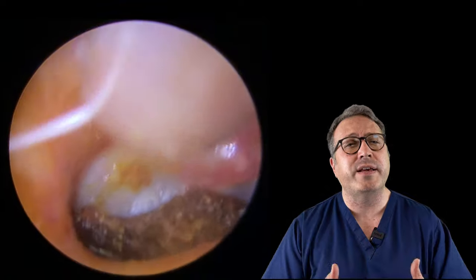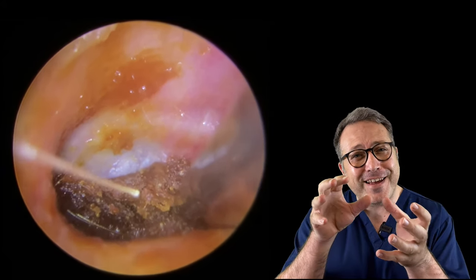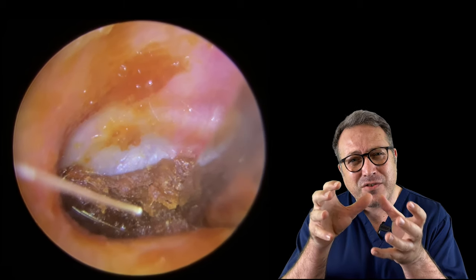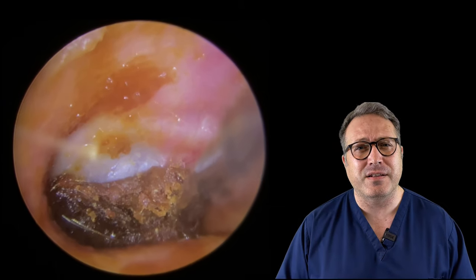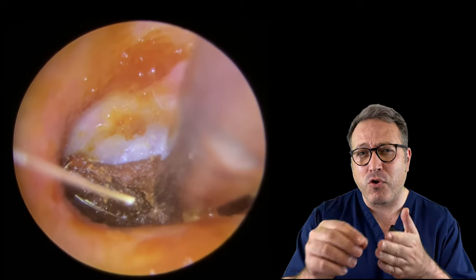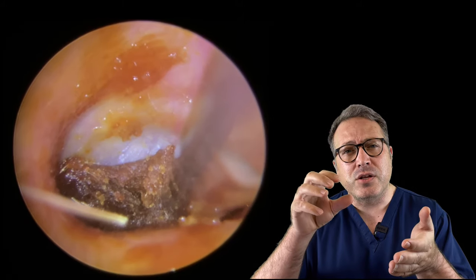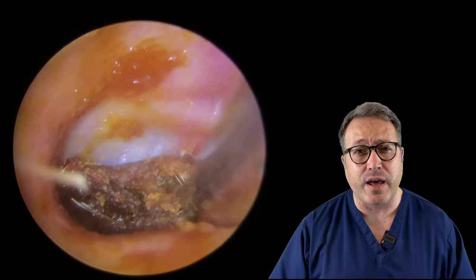Just taking this little bit away - we've got that solid, really old dry wax right against the eardrum. It's really, really tough in there. Now we get to this last little bit - I'm struggling, and you can see me probing various points along the surface of this wax, trying to find any loose section.